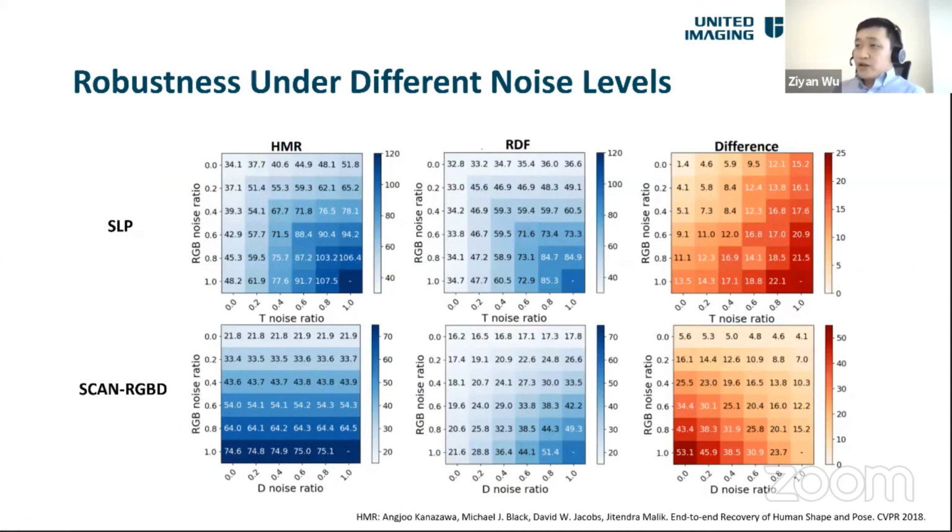And lastly, we also want to quantify the robustness of our algorithm to noise. So we vary the probability of a particular modality missing at test time. With probability P, the x-axis here, we replace each image of the modality with a 0 array. Basically, we black out random modalities during test time.